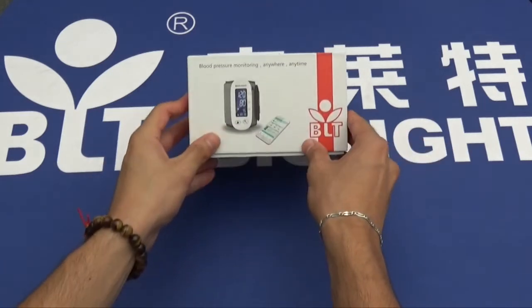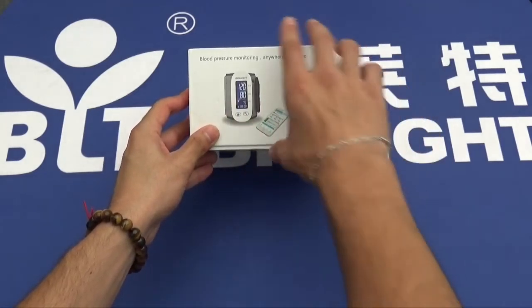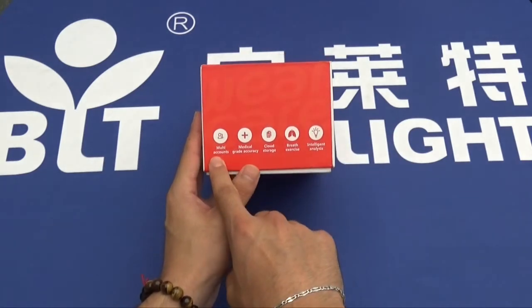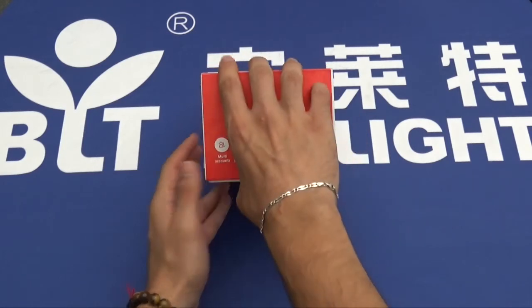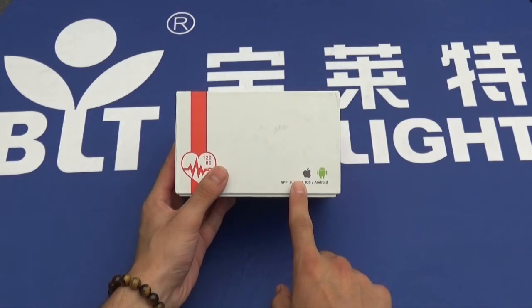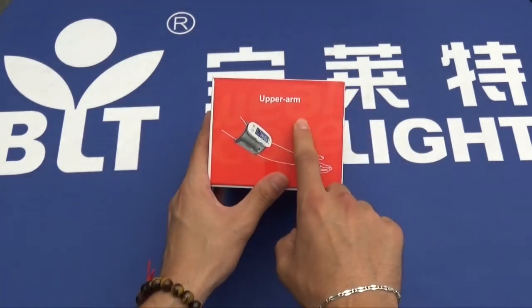Having a look on the box, we see that it's compatible with all types of mobile device, has multi accounts, medical grade accuracy, cloud storage, breath exercise, and intelligent analysis. It's compatible with iOS and Android and it's intended for use on the upper arm.